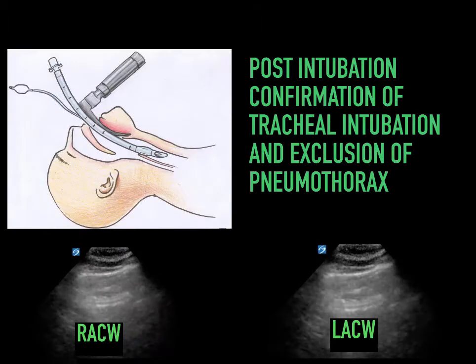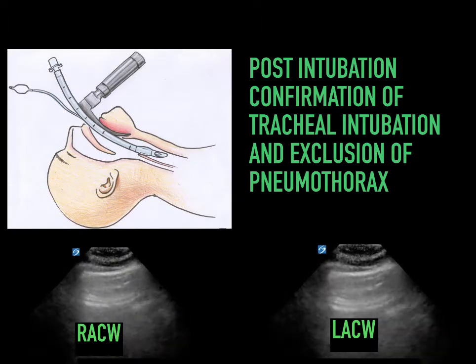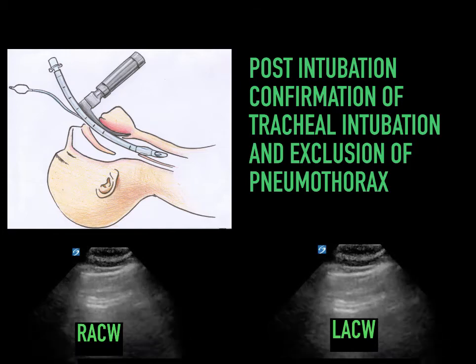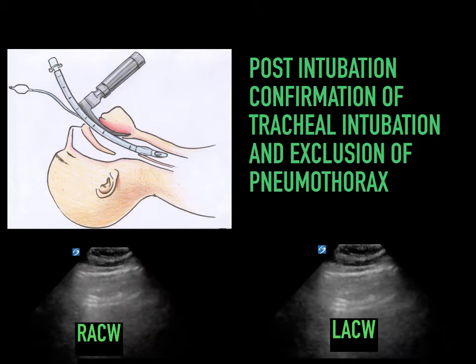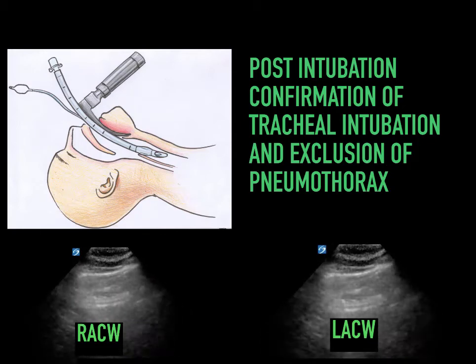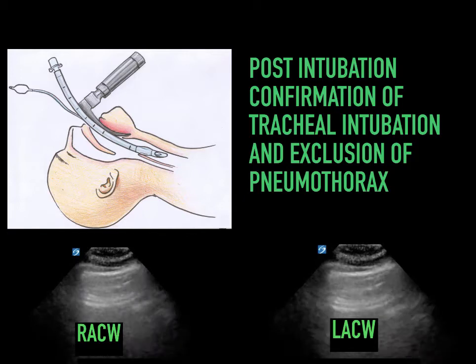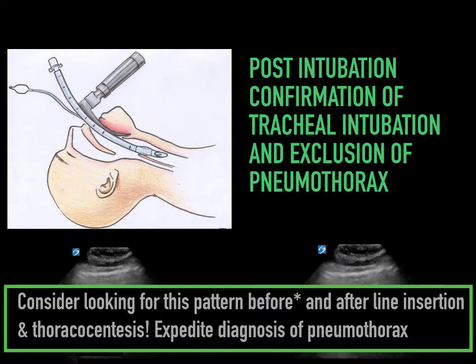We can use lung sliding to confirm tracheal intubation and to exclude mainstem intubation on either side, and to exclude post-intubation pneumothorax. As we can see here in both images, post-intubation we have lung sliding demonstrated on either side of the thorax. We can look for this pattern before and after line insertion and thoracocentesis, which can really expedite the diagnosis of pneumothorax.